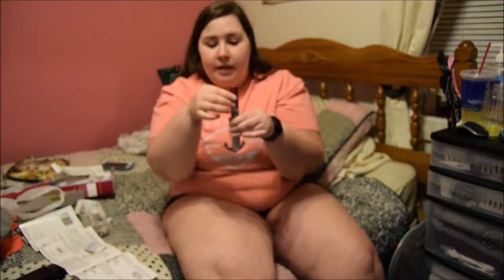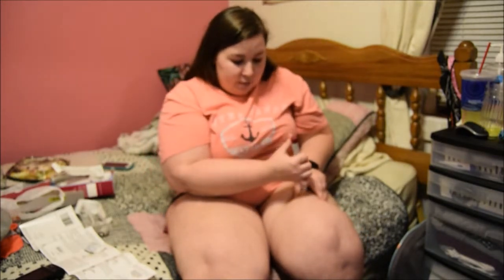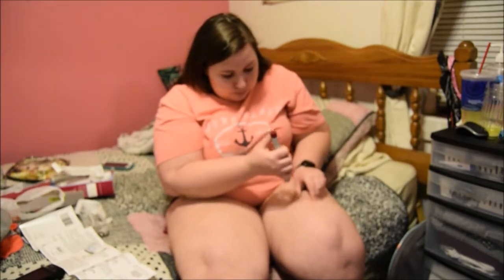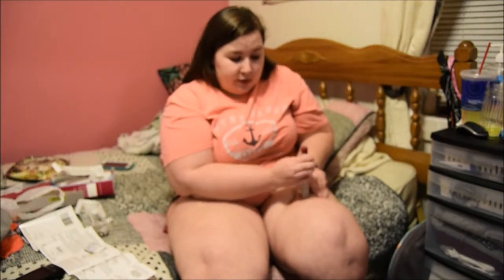I'm going to flip it now to the side that has the pin on it. I'm going to do this. Again, straight up. Do not pull. And then right where I got it, I'm going to squeeze my leg so that you don't hit a vein or anything. So I'm going to squeeze it like this. I'm going to put it in the position. So I'm going to squeeze it right where I injected it, and I'm going to push a button, and I'm going to wait 10 seconds, count it out, and yeah, so here we go.